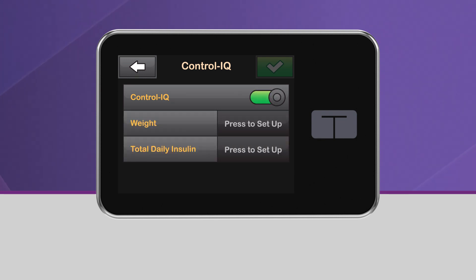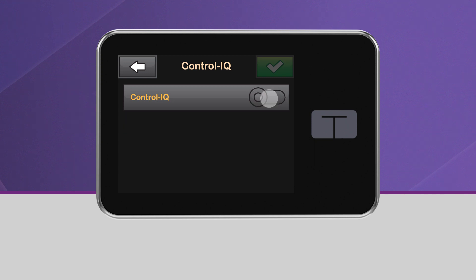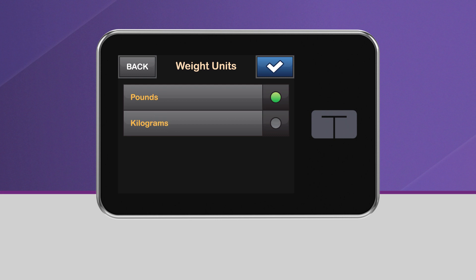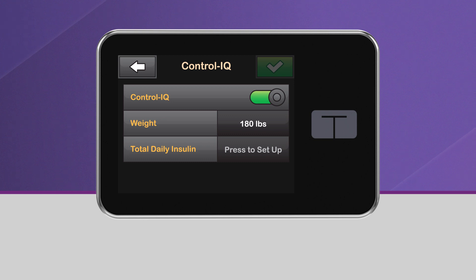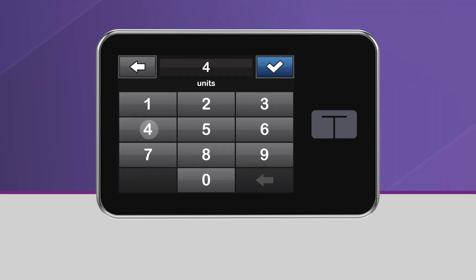You may also turn Control IQ off from this screen by using the same toggle. When you turn Control IQ Technology on, you'll need to enter your weight in pounds and your average total daily insulin use in units. Total daily insulin should be entered based upon the best estimate of total basal and bolus insulin you require in a 24-hour period.